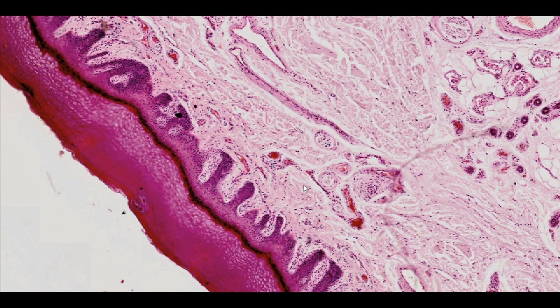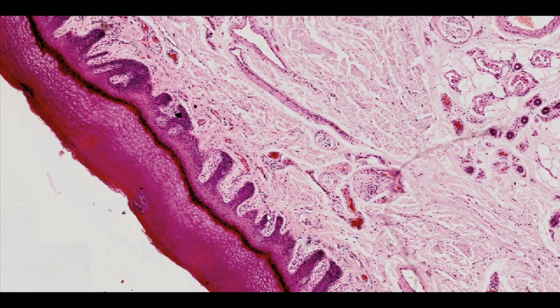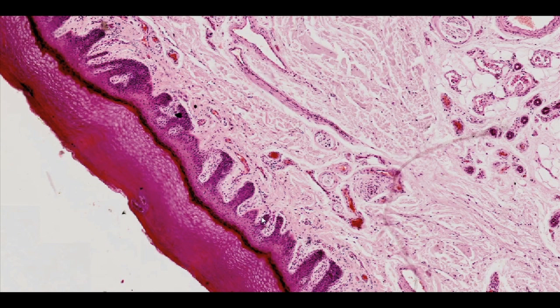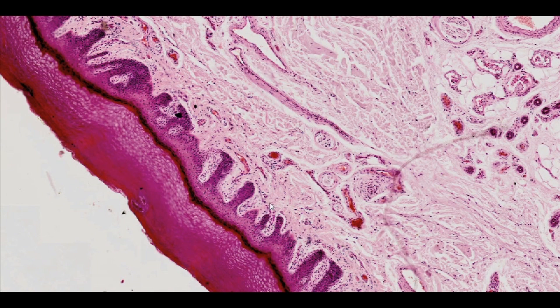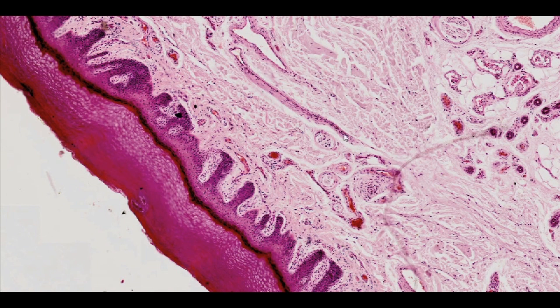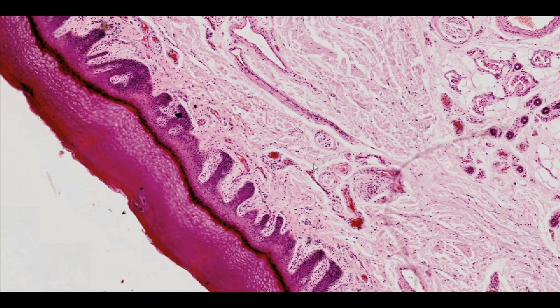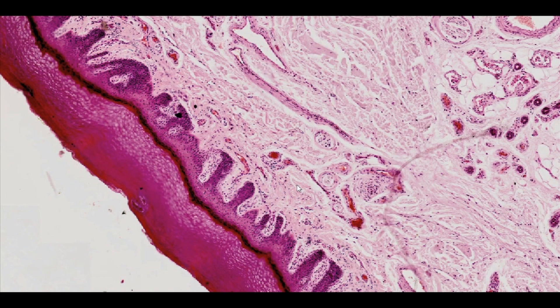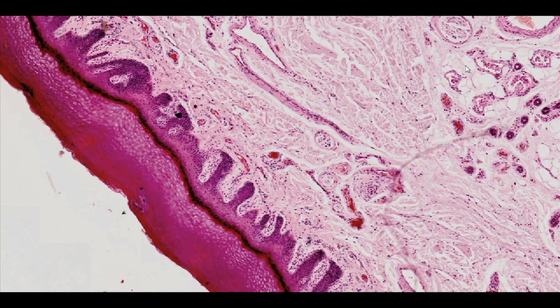Two layers are distinguished: the papillary layer, located just beneath the epithelium, consisting of loose connective tissue, and the deeper reticular layer, made of dense connective tissue.